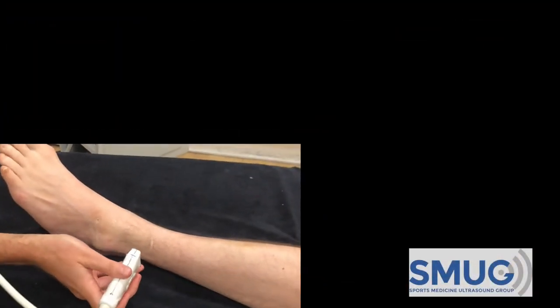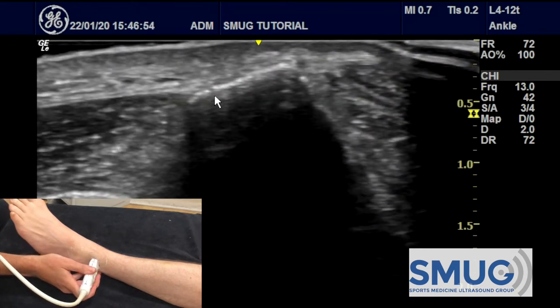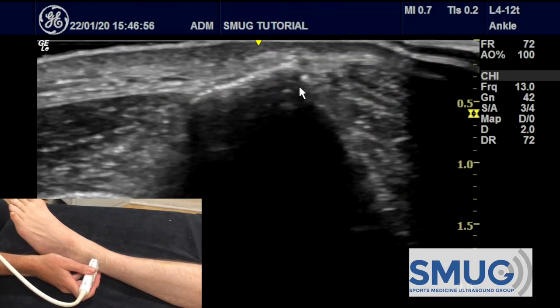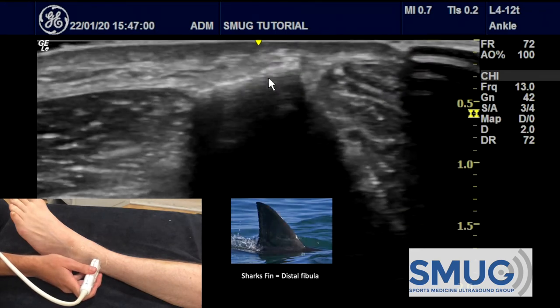To scan the lateral ankle, we first start at the fibula. The fibula, you can see on the screen here, has the shape of a shark's fin, so the first thing to do is to find this shark's fin.